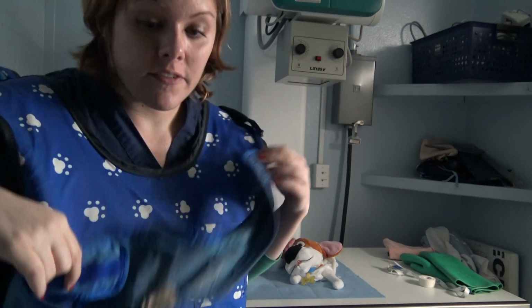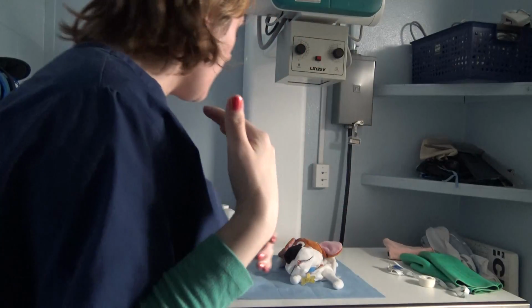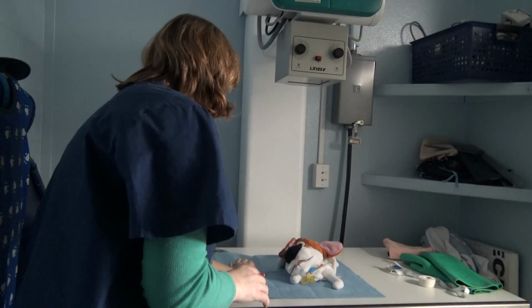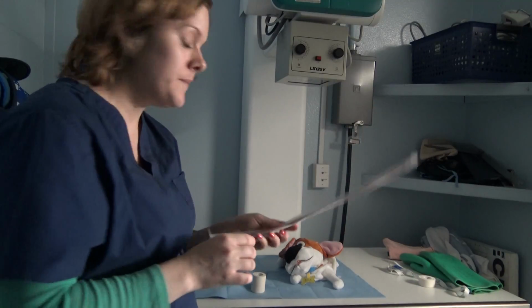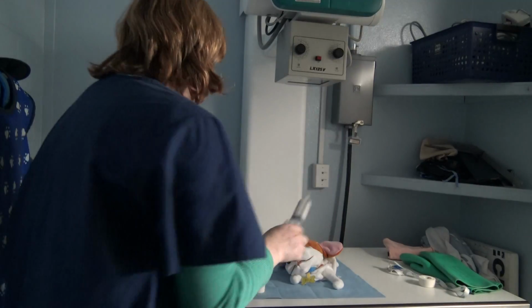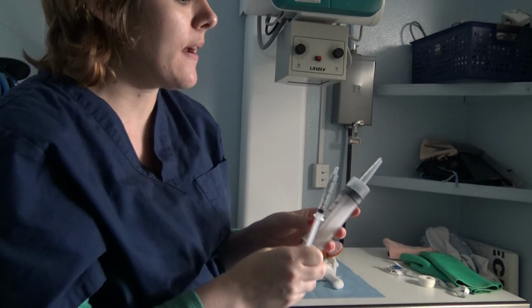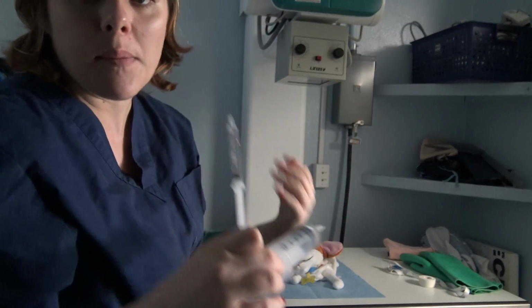So I'm going to take this off for a second because it's heavy, and go through all my process of demonstrating the barium. So we have our mouth gag. I have my loop here. I have my stomach tube. I have my 54 mils of barium that I calculated. I have a couple of mils of water because I'm going to test to make sure that the tube is in the right place before I enter the barium. And then I have 10 mils to follow up the barium with, which should get it all out of the tube and make sure it's into the patient.